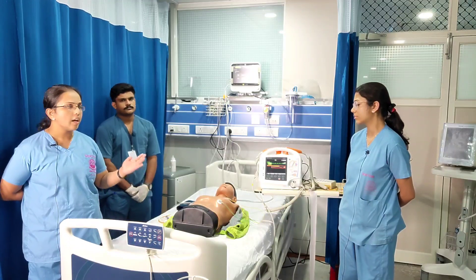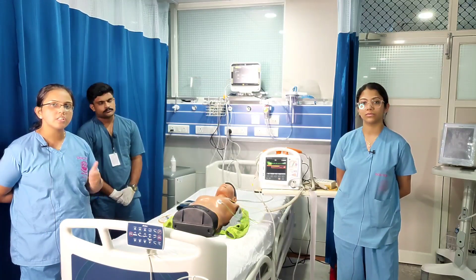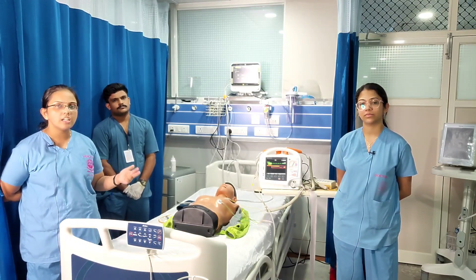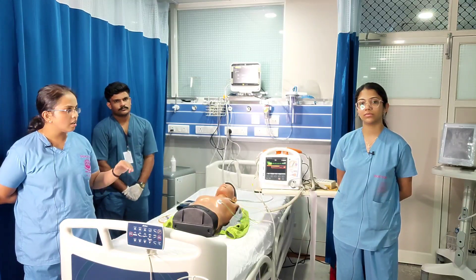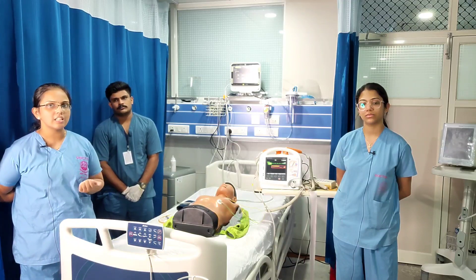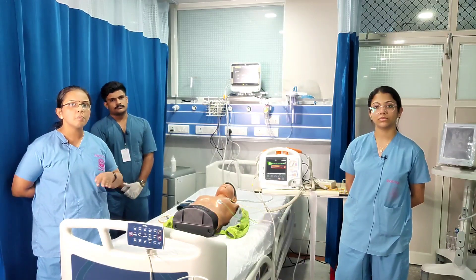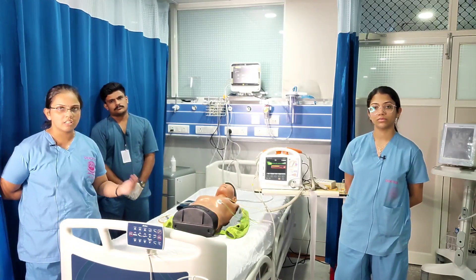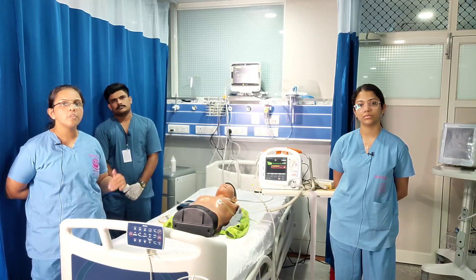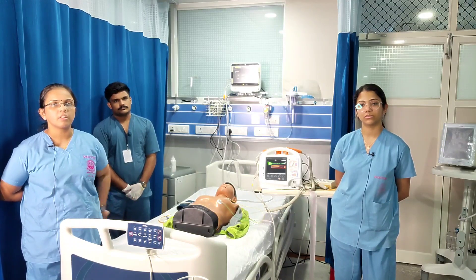After DC cardioversion, we check for response. The rhythm was converted to sinus rhythm with a heart rate of 120 per minute. On re-assessment: no signs of airway compromise, breathing was normal, and BP had improved to 100/60 mmHg. This is how we manage wide complex tachycardia per ACLS guidelines — initially pharmacological management with amiodarone, and when the patient became unstable, we proceeded with synchronized DC cardioversion, successfully reverting to sinus rhythm.